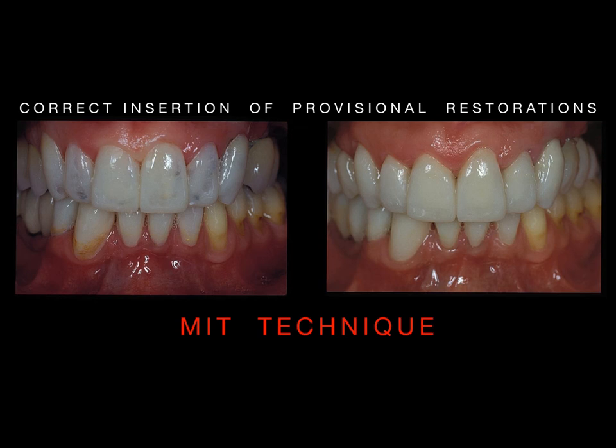That is an example before relining on the left side and after relining on the right side. All the margins are of course comprehended inside the shell, and once you reline, you remove all the excess, and it's very easy to arrive at this level and to achieve this kind of result.